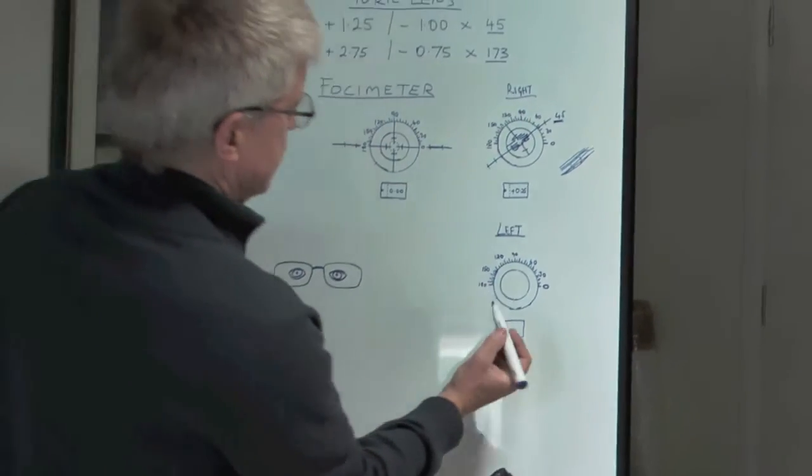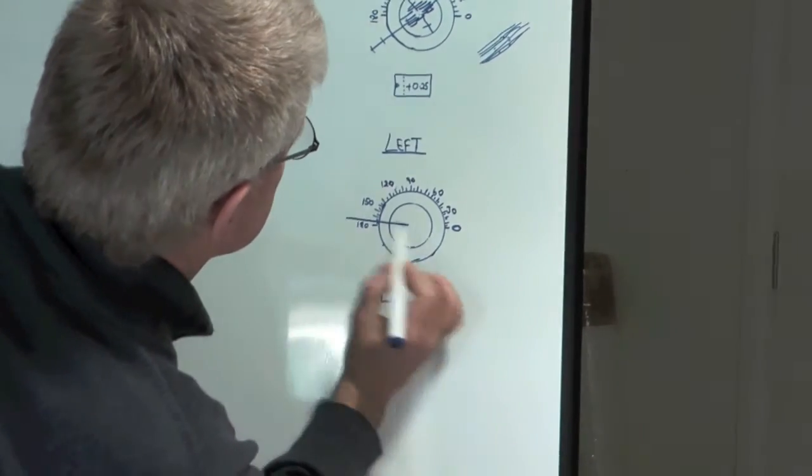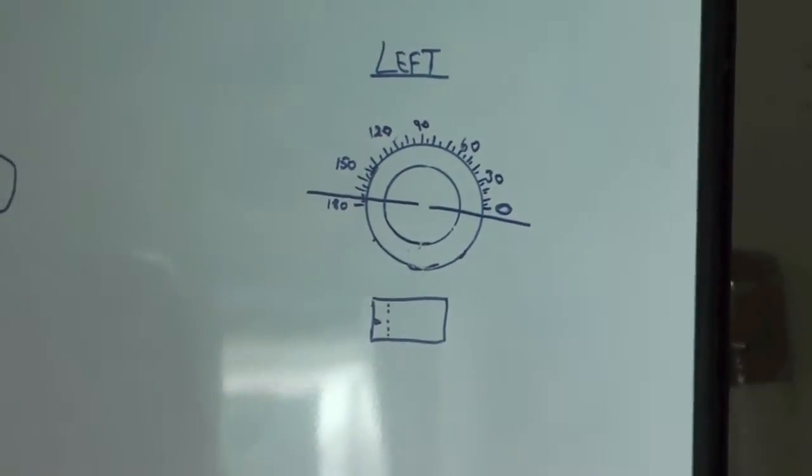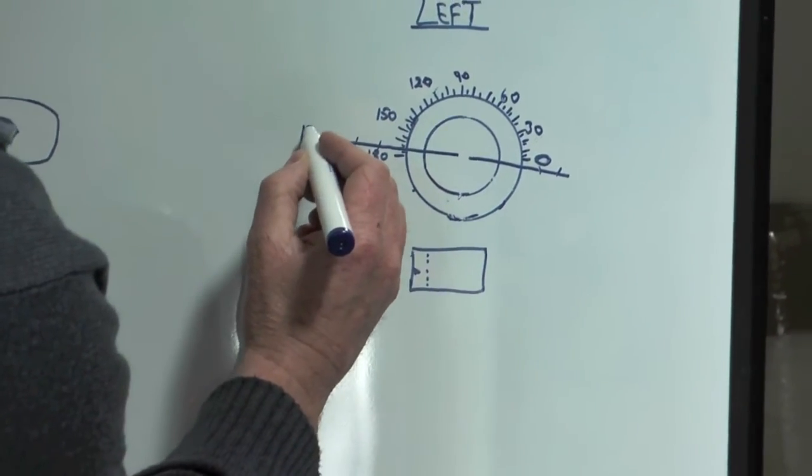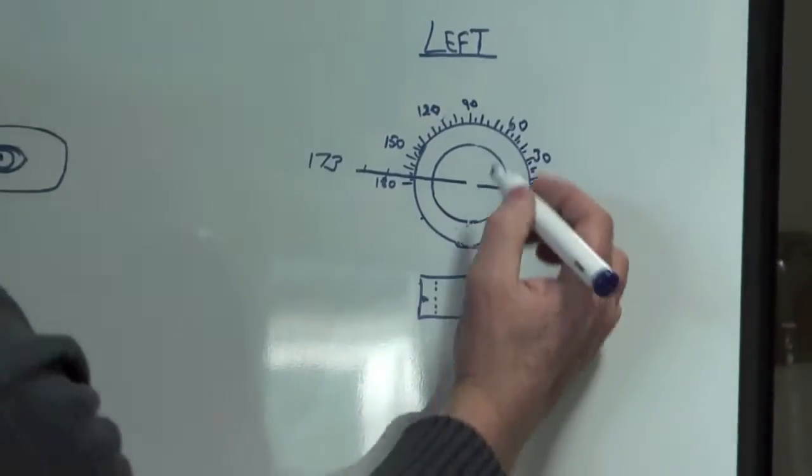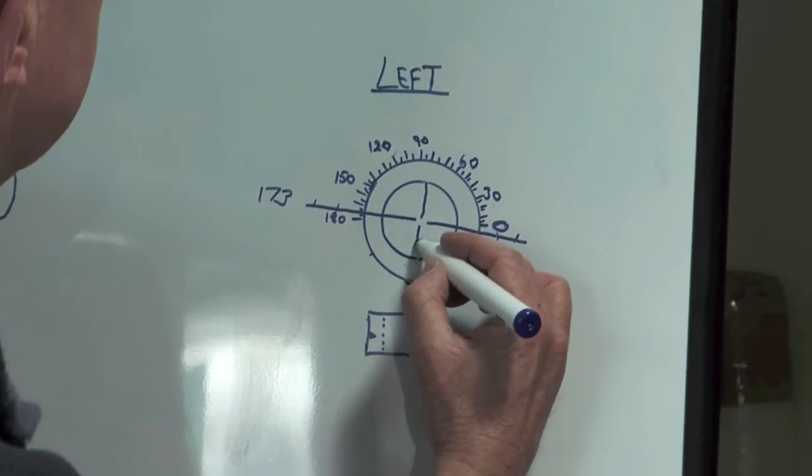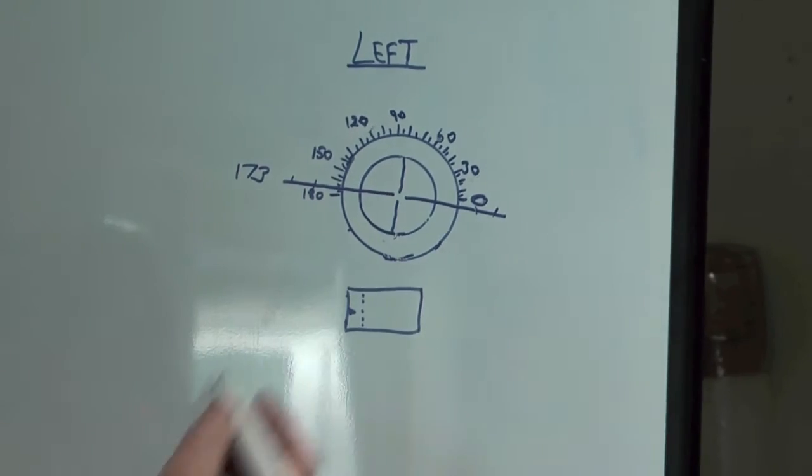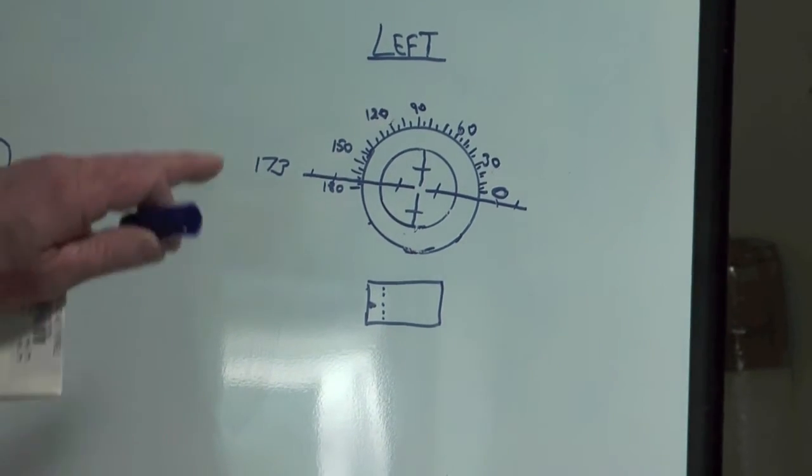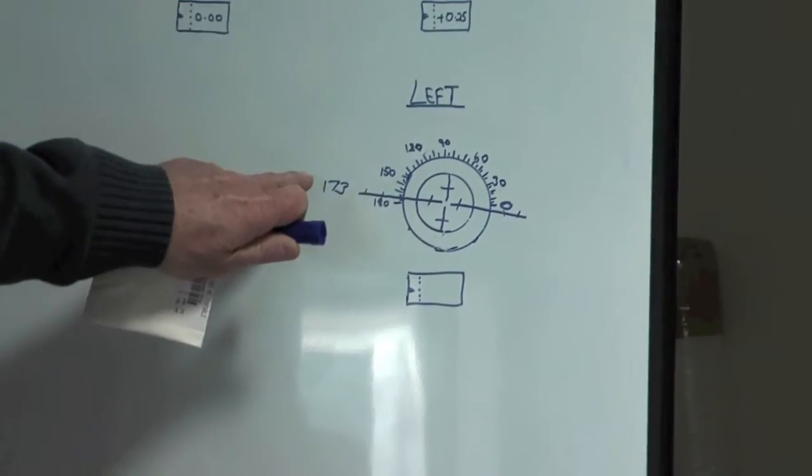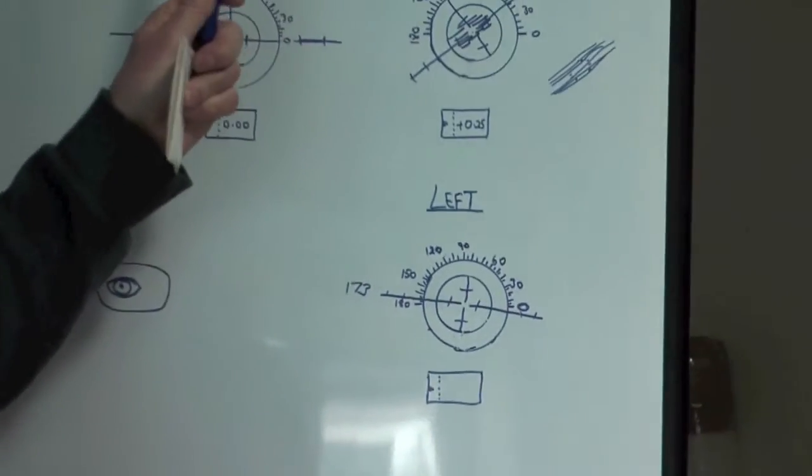When I look through there, we've got a line going from there like that, just below the zero. This is axis 173. If we go 90 degrees to that, we've got 83. This is always 90 degrees to each other. When you look through the focimeter now for the left eye, I've set it with the axis at 173, which is what we want.